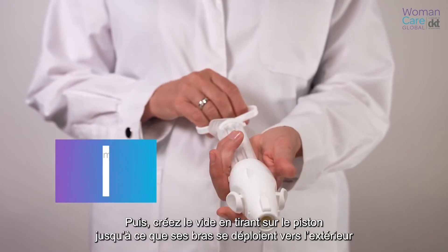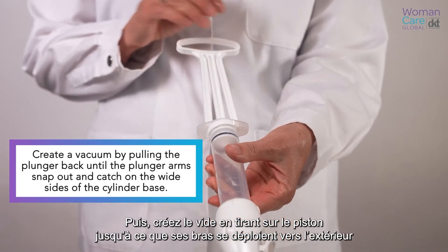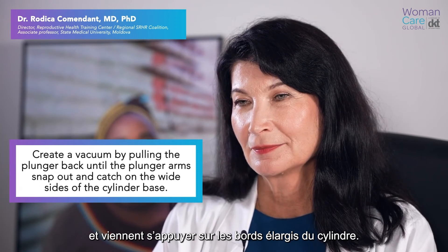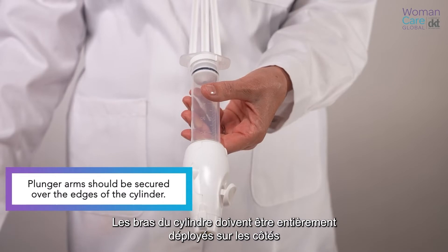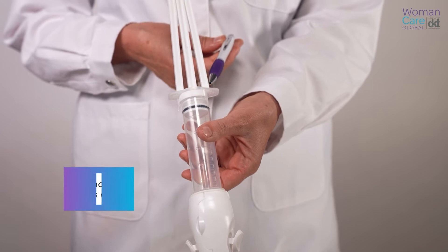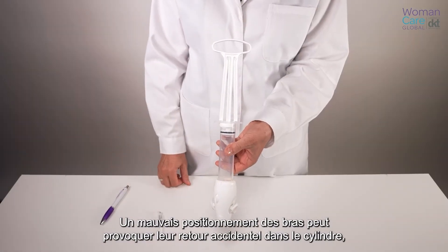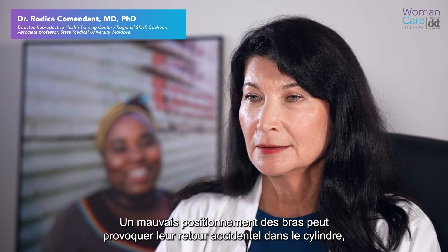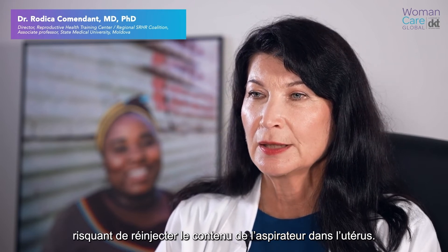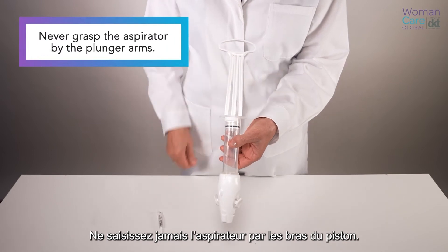Next, create a vacuum by pulling the plunger back until the plunger arms snap out and catch on the wide sides of the cylinder base. The plunger arms should be fully extended to the sides and secured over the edges of the cylinder. Incorrect positioning of the arms could allow them to slip back inside the cylinder, which raises the risk of injecting the contents of the aspirator back into the uterus. Never grasp the aspirator by the plunger arms.